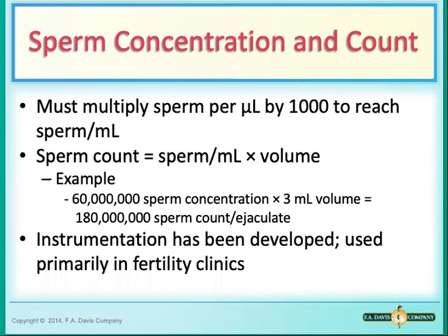million sperm per ejaculate. All right, the book on page 282, in your chapter 11, has 2 different examples: one using a 1 to 20 dilution with 60 sperm counted, and one using a 1 to 20 dilution with 600 sperm counted. So this is the typical method, the manual method of counting sperm and looking at the sperm concentration.